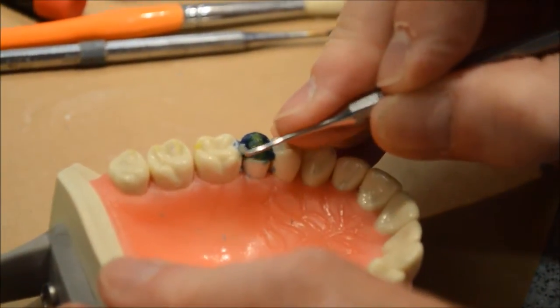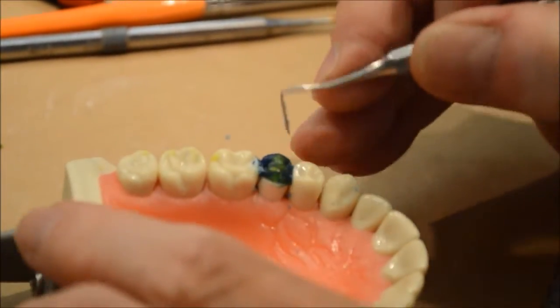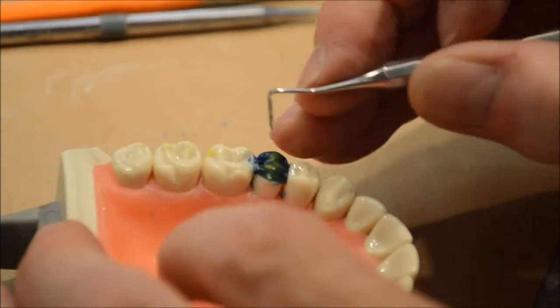I'm still working on my embrasures — make sure that they go through the contour right. I'm using the adjacent tooth as a guide to make sure that my contour is correct.